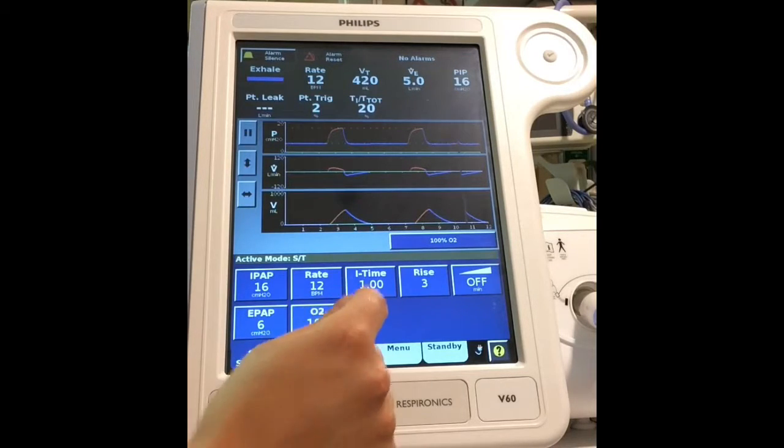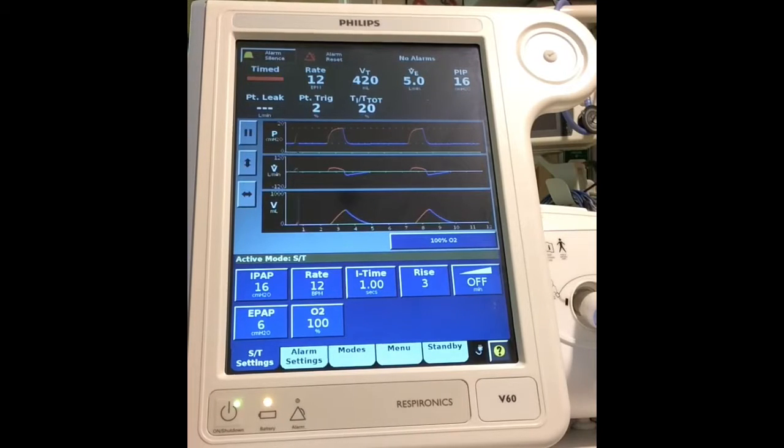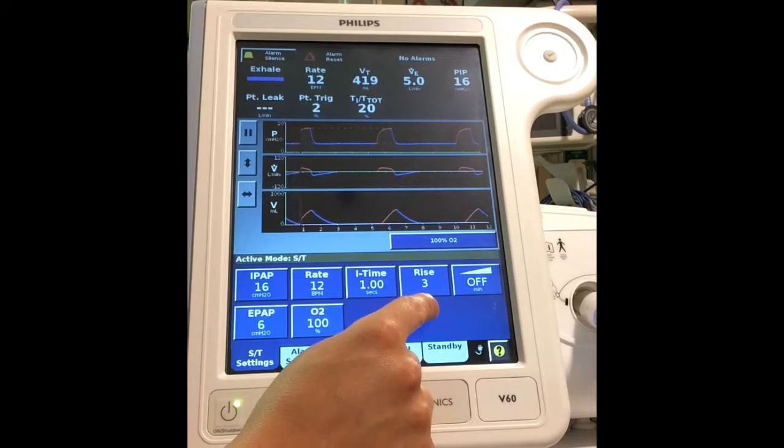I time. That's how fast your breath is being delivered. That only works on a machine breath. So if it's a spontaneous breath, it does not work. Your patient is allowed to determine their own I time. Rise. This is a fun little one to work with.